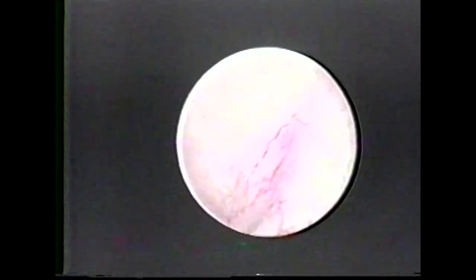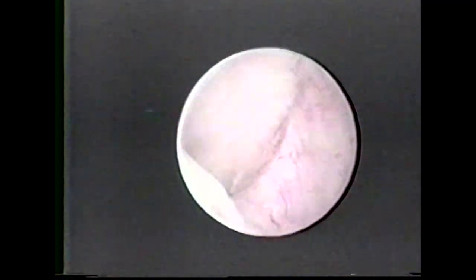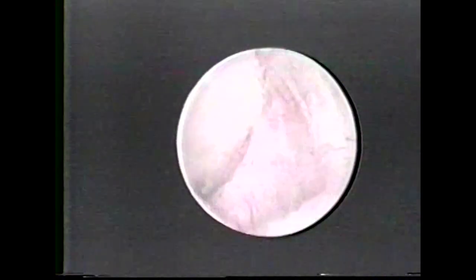Initially, on endaural puncture, the posterior bilaminar zone and oblique protuberance can be readily visualized. Note how the medial trough visualization and access is facilitated.